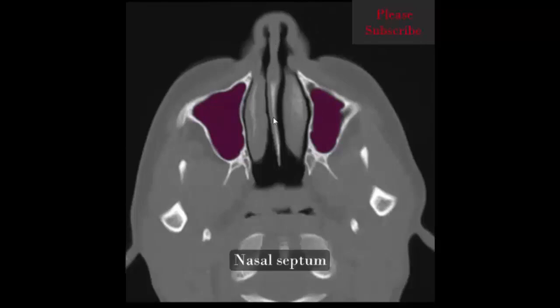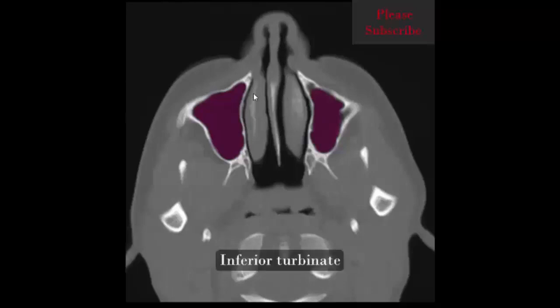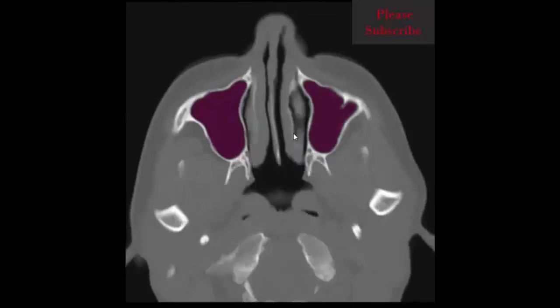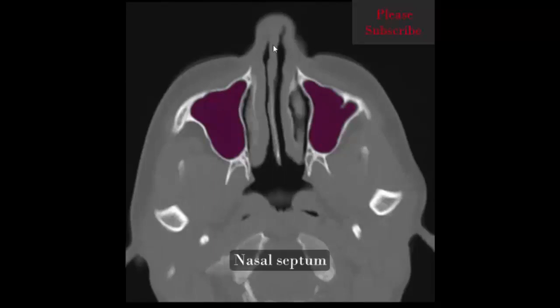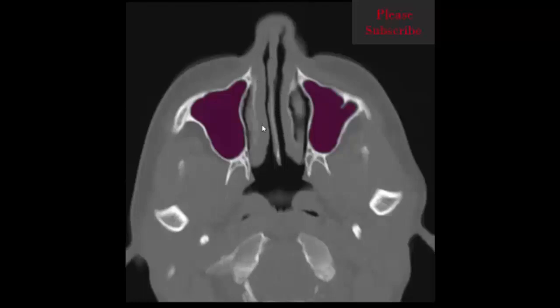At the next level, we again identify the nasal septum, nasal cavity, right and left inferior turbinate, and right and left maxillary sinus.